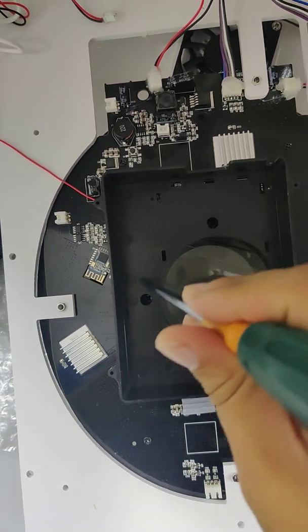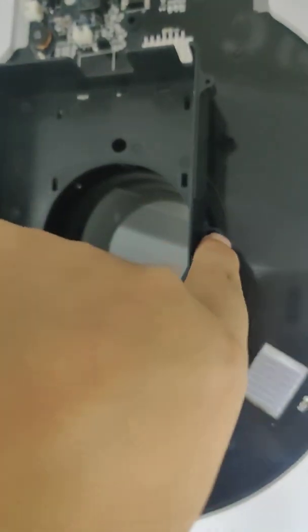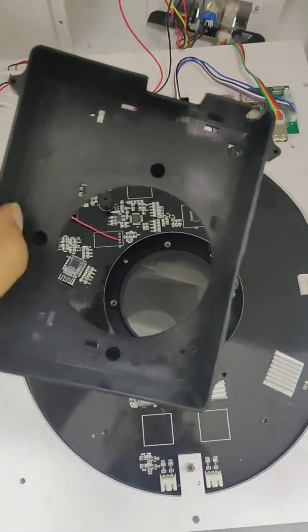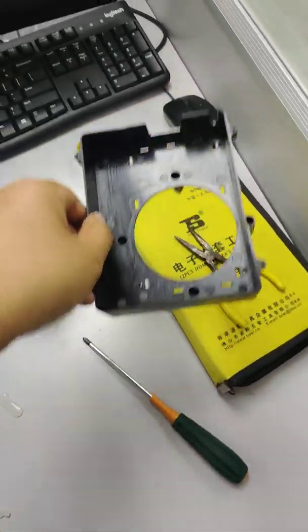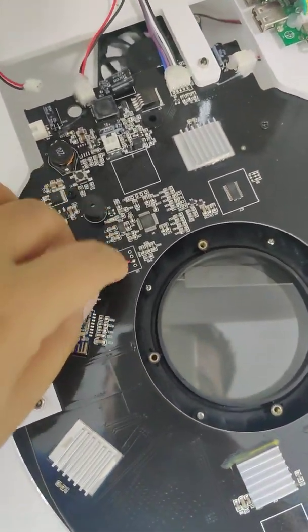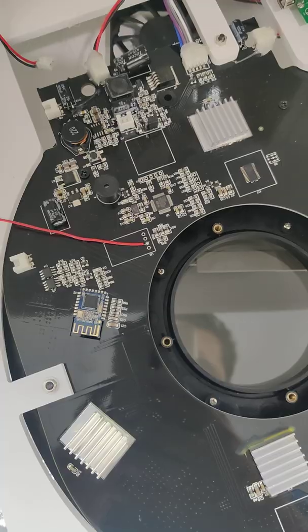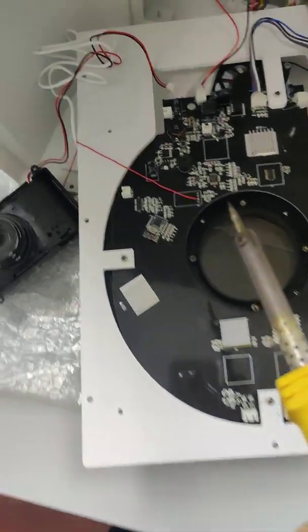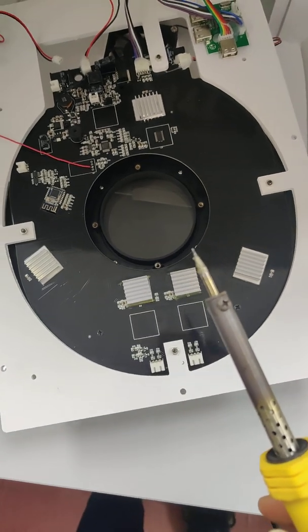1, 2, 3. Okay, these 3 screws and this also need this. Okay, now I can take this off. Okay, look, it's just like this. Now we can see this cable is connected to here. Then we should find this electric iron to heat this up so we can take off this cable from this panel.